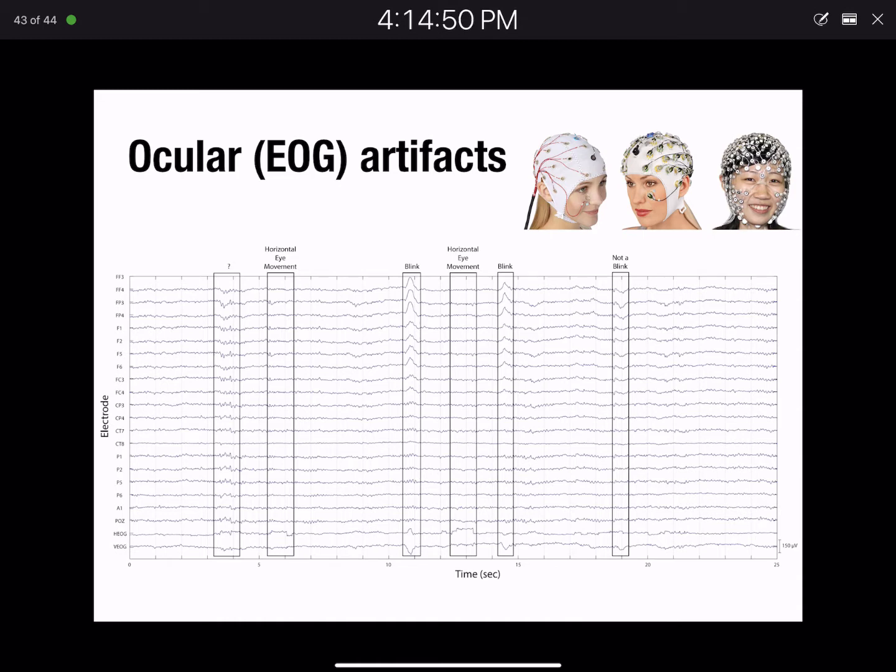And this is actually important in recognizing these. The eye movement's a little less clear here, but if you look down at the bottom, the second from the bottom especially, you can see a little square plateau there. Usually what happens, that's when somebody looks, say, to the left and then back to center. As it goes up, that's looking to one side, flat as long as they're looking there, and then it drops back down when they move back to center.